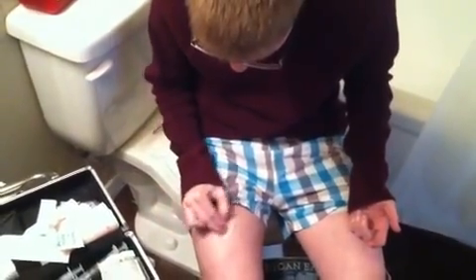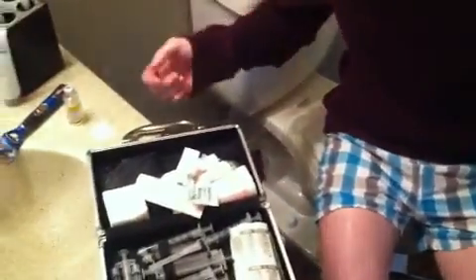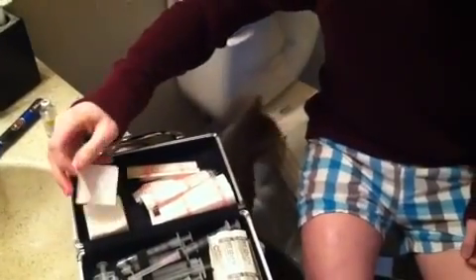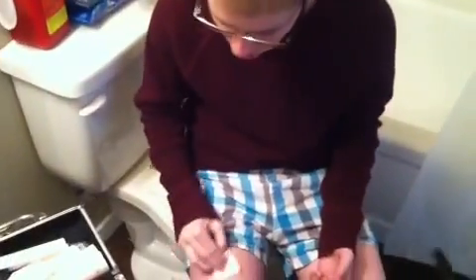You get your alcohol swab, you're going to swab the area, and then I usually have my trash can right here, but I knew my cats were going to get into it. Then you want to chuck your swab in the trash can, and then you want to dry the area with a gauze pad, so you just dry the little area. Don't forget where you cleaned. Whatever you do, don't forget that.